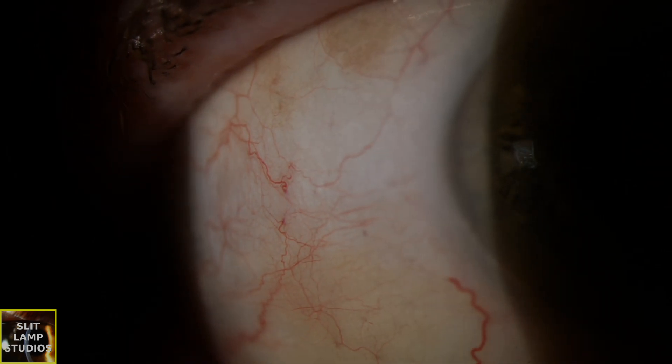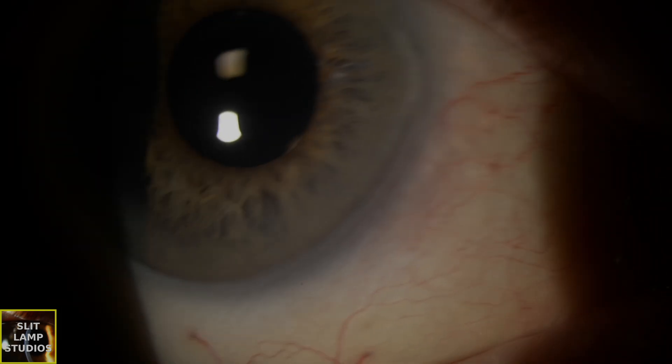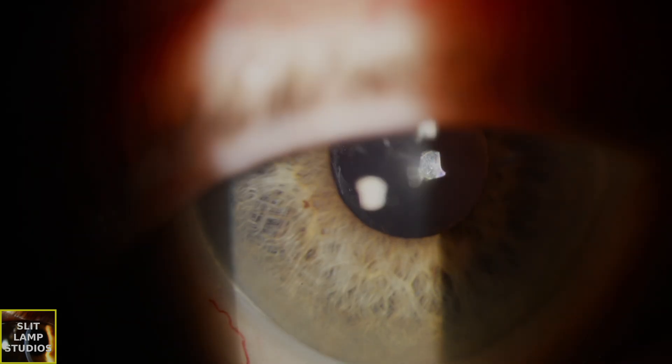We could have a look at the fundus now. So let's try and get out of our lens box, our 90D lens. Let's have a look at that capsular axis, that anterior capsule. We can see that there's some beginnings of posterior capsular opacification there. Anterior segment looks otherwise unremarkable.